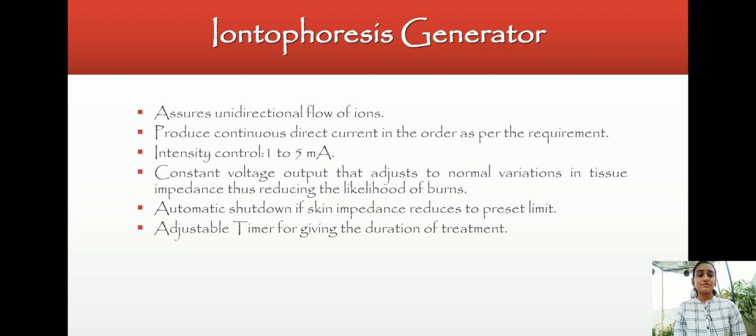Oh, that's a very good advantage here. And an adjustable timer for giving the duration of the treatment. You can also control the time accordingly. Now, this is a picture of a generator. This is how it looks.